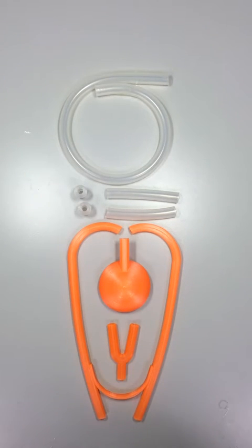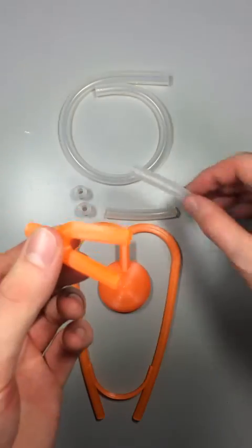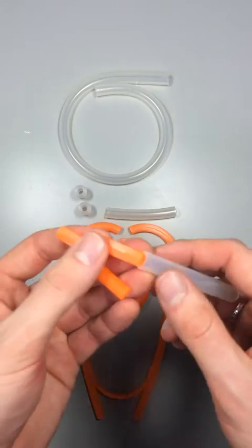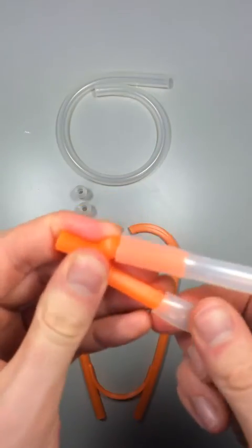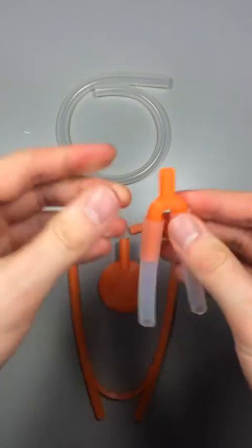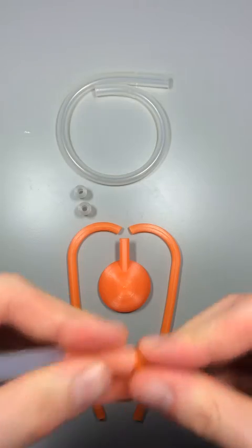To put it together, it's pretty straightforward. If we just take the U-shaped joiner, the smaller sections of tube go on the longer sections of the U-shaped joiner. Everything's press fit, so it doesn't require any glue or any other adhesives. You can just slide everything on. You should feel a little bit of resistance, but it should go together nice and snug.